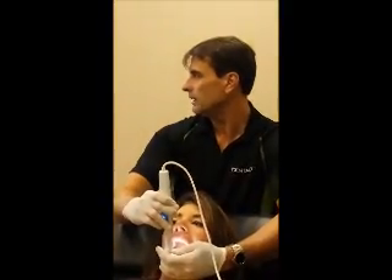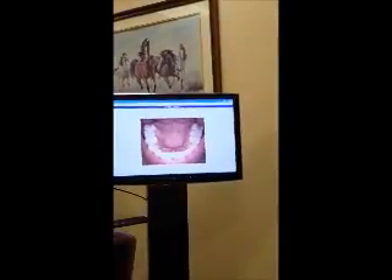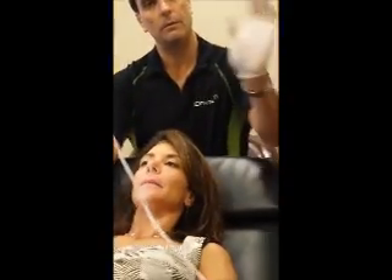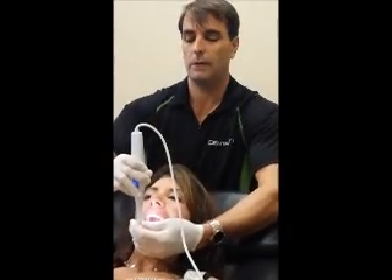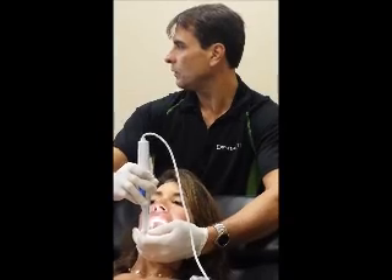One technique is to ask the patient to keep their mouth open and smile. Notice it retracts the teeth from the upper arch so we can get a more clear image. The technique for upper arch is straight down with the camera. I'm creating a handhold on the chin and a place for the head of the camera to rest between my thumb and index finger. Open a little wider, please.